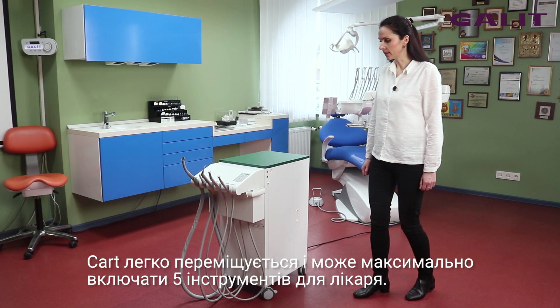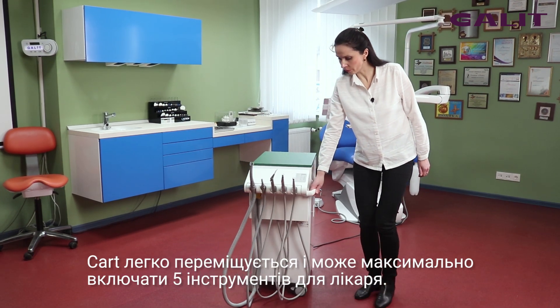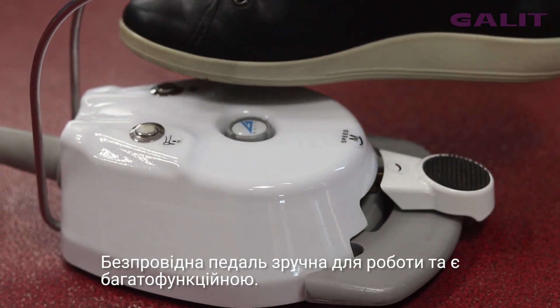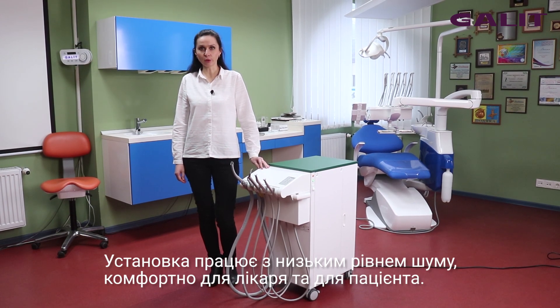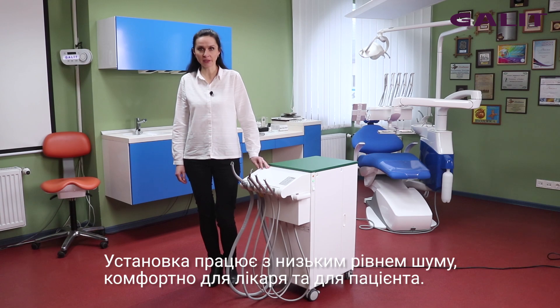It is very easy to move the card and it can include a maximum of 5 instruments for doctors. Wireless foot control is easy to operate and it is multifunctional. The unit is of low noise and very comfortable for both dentist and patient.